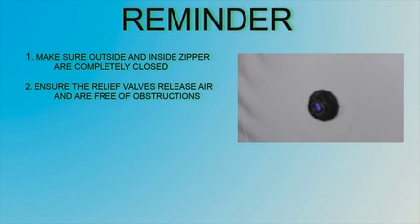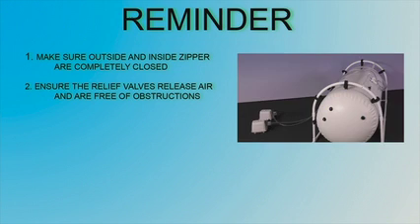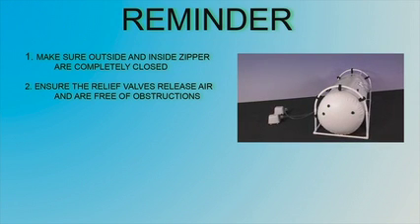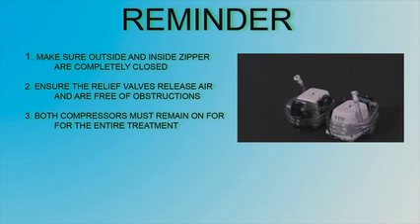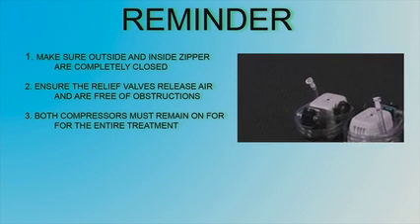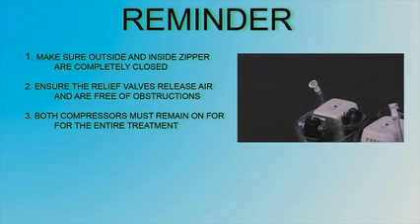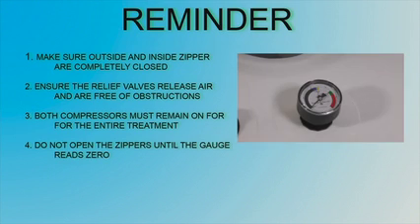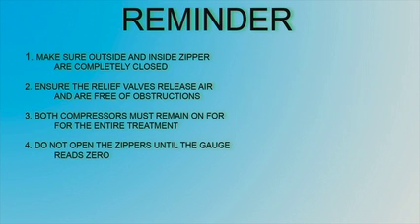If the blue relief valves do not release air when it is at full pressure, stop your treatment and call your distributor. It is important that the relief valves are clear of all obstructions inside and out during your treatment. The compressors must remain on for the entire treatment. This ensures the circulation and exchange of fresh air to provide a safe and comfortable treatment. Do not open the zippers or unbuckle the straps until the gauge reads 0.